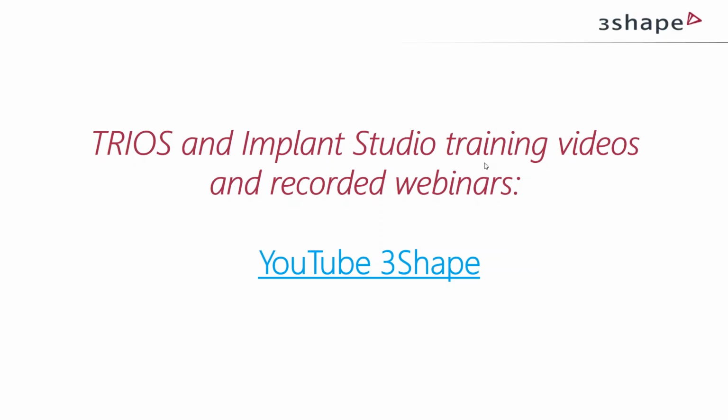We have the last question of today. What do I need to start working with Implant Studio? As a dentist, when I'm sitting here in my clinic, or as a lab, I'm thinking, okay, this webinar was nice. What do I need? I want to get on board with this. Where can I go and who can I talk to?